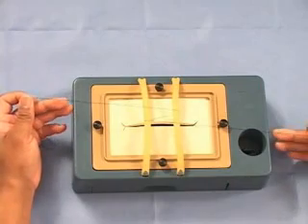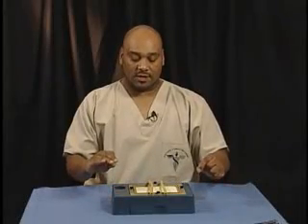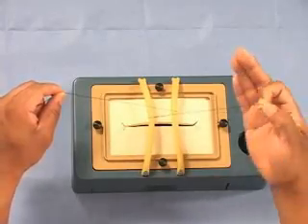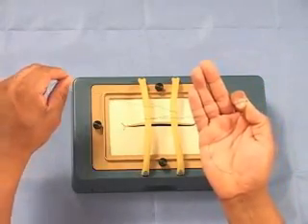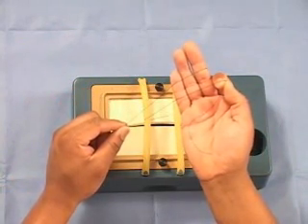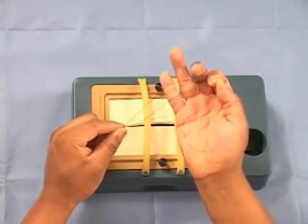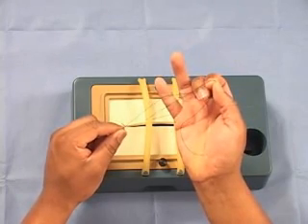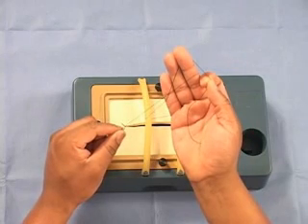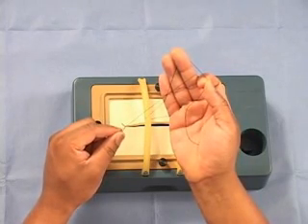Now, let's practice tying this knot. Start off with the near strand in your tying hand, palm down. Now, rotate palm up. Let the far strand go over the top of your tying hand. Now, bend the middle finger and trap the near strand in between your middle finger and ring finger. Now, let go with your index finger and thumb.